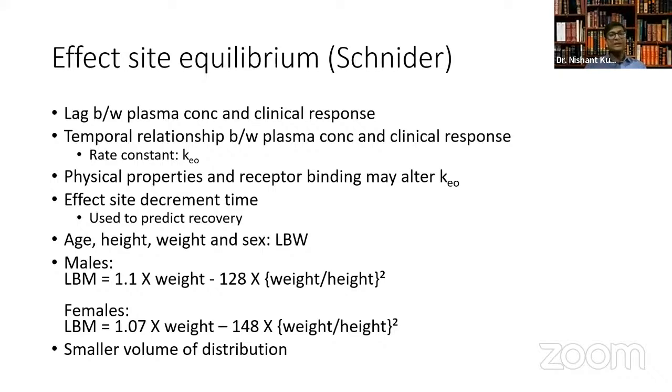It can also be used when we are using the effect site equilibrium model, in the effect site decrement time. It can tell you how much time is left. Right now my effect site concentration is say 4 microgram per ml of propofol. If I stop my pump at this time, how much time will it take for the patient to wake up? This can also be calculated by the machine and the computer.